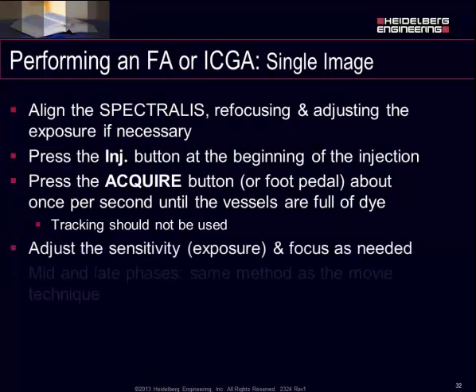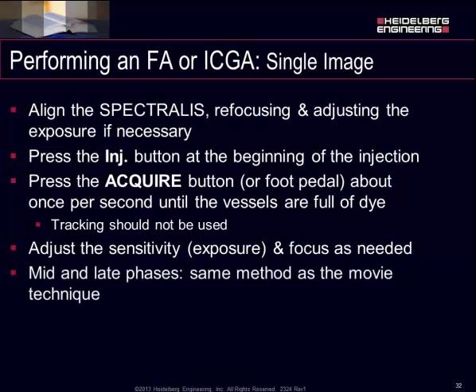The mid and the late phase photographs will be the same as the movie method. So you'll still do the single photographs, you'll use the tracking, and you'll acquire those images just like you would have with the other method.